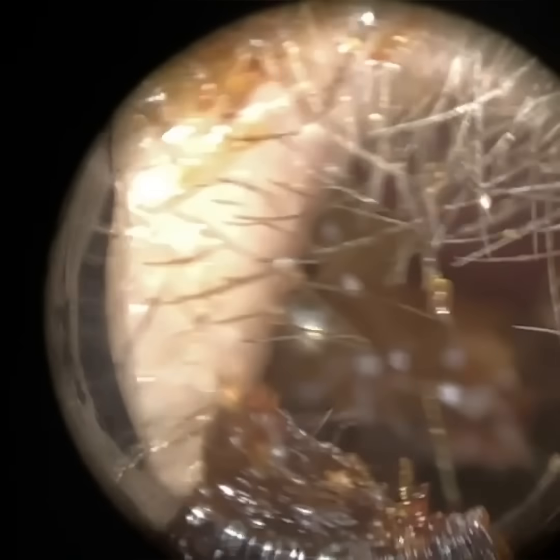So we've used forceps, we've used the right one there. We're bringing this forward slowly. So I'm just going to the back part of the ear canal, trying to glide in and push this away from the back part of the ear canal.